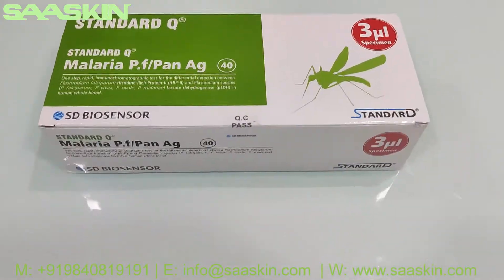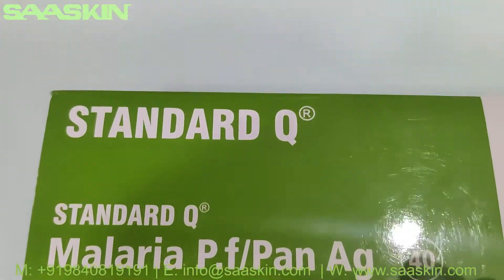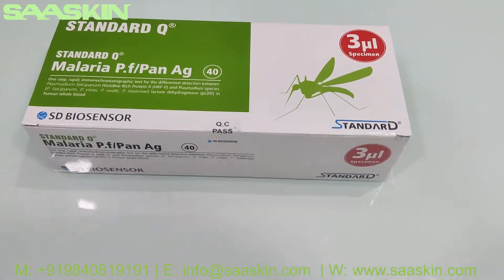Hello everybody. I am going to show you the unboxing of SD Biosensor Standard Q Malaria PF Pan Antigen Test Kit. This is a 40 test kit box, and this is how the box looks like.